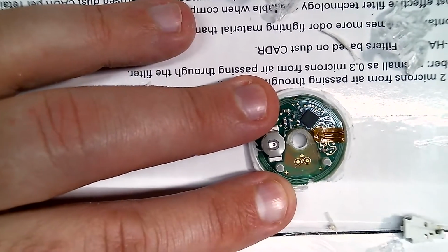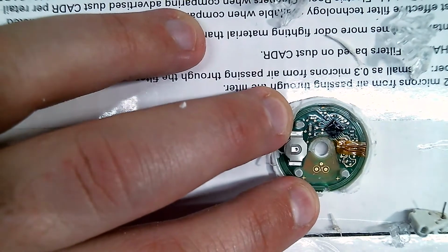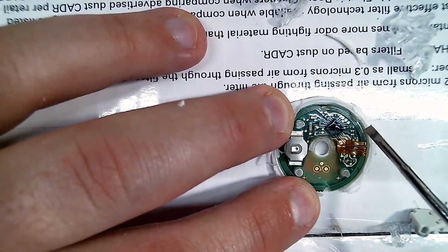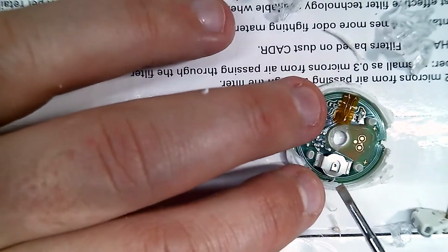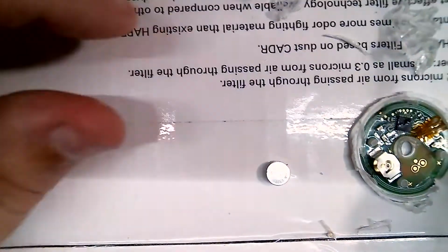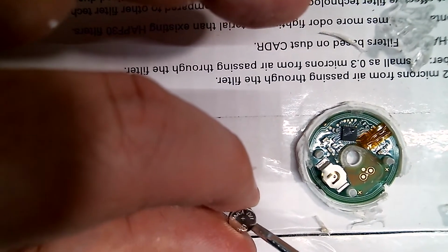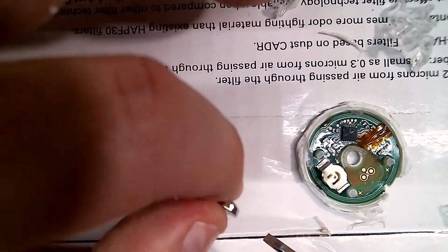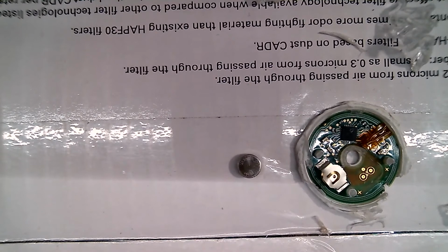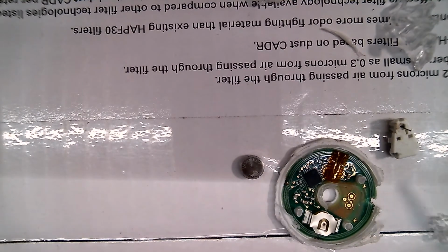Yeah, I can't read the writing at all. Yeah, can't read a damn thing on there, so that's no good, but this thing is tiny. Just out of pure curiosity, the battery. I'm going to assume the battery is still perfectly good. Even without, so what is that? It's Varta V377, but it's probably perfectly fine because it wasn't in there more than a few days. So yeah, standard cell, antenna, contacts for the actual little tiny sensor, and that's about all that's in this thing.